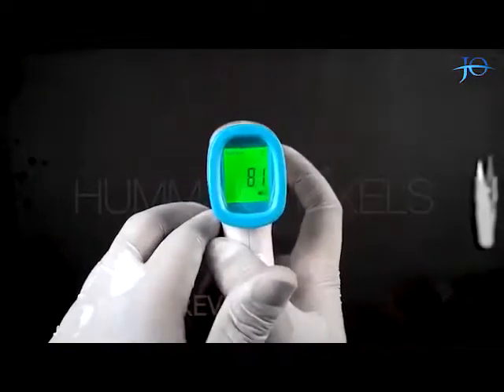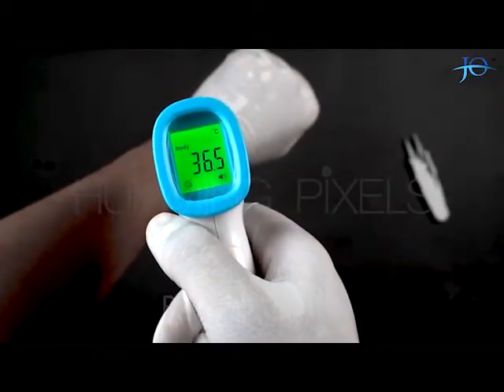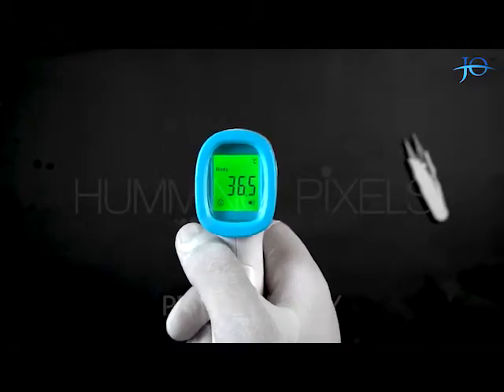Now we will see how it works in body mode by pressing the Mode button. I will check my body temperature by pointing the sensor towards my hand, and here we have the reading on our screen. The green light here indicates that it's a normal body temperature.